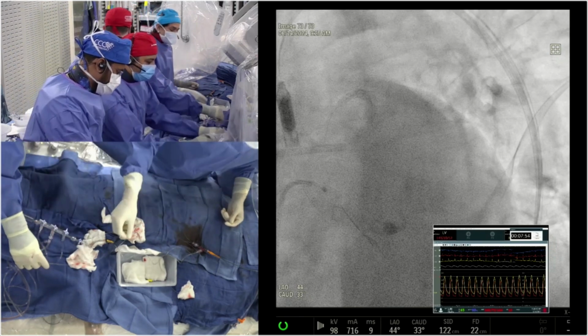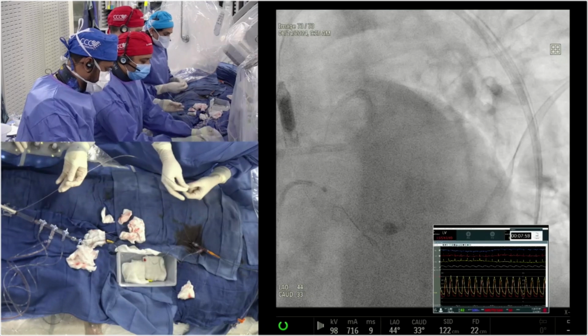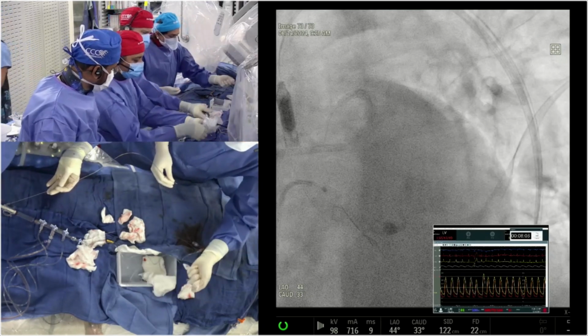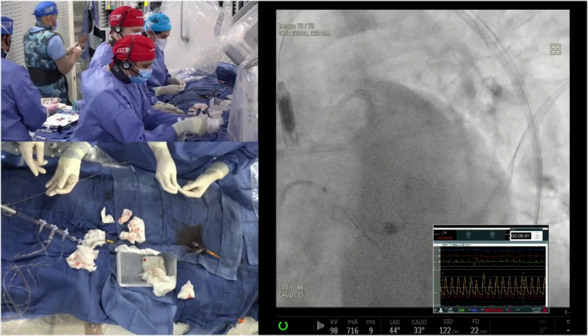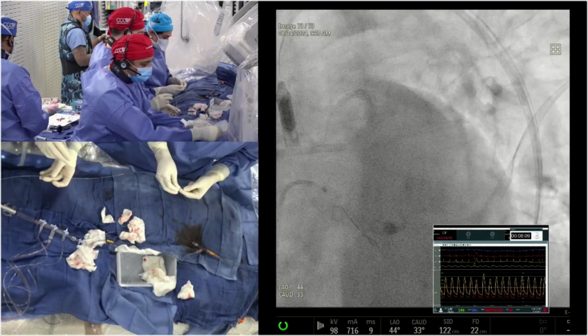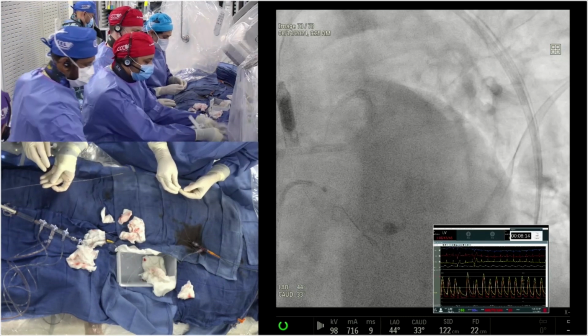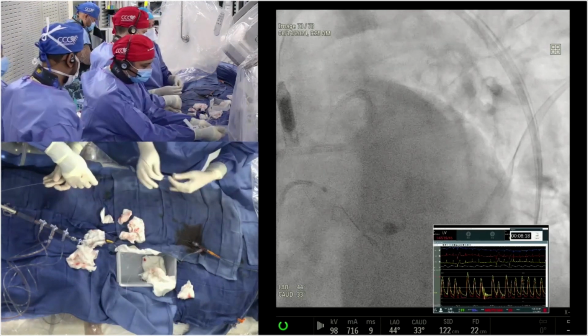So for nodules, actually, Pedro, go ahead. Yeah, Pedro, we actually have submitted our analysis of imaging using OCT and IVUS both on the nodule. It has been accepted at ESC, and we have a big calcium section where we'll be presenting our findings. So the question is the same.